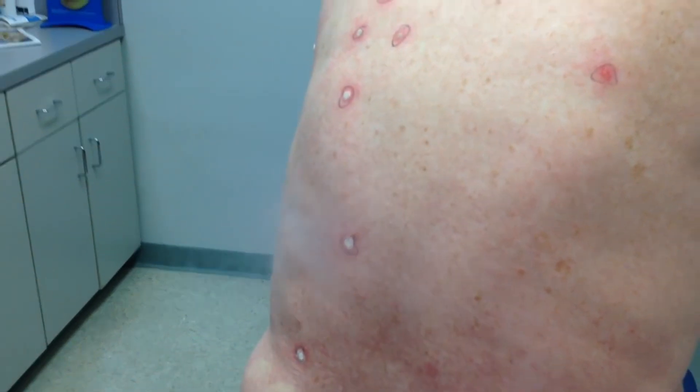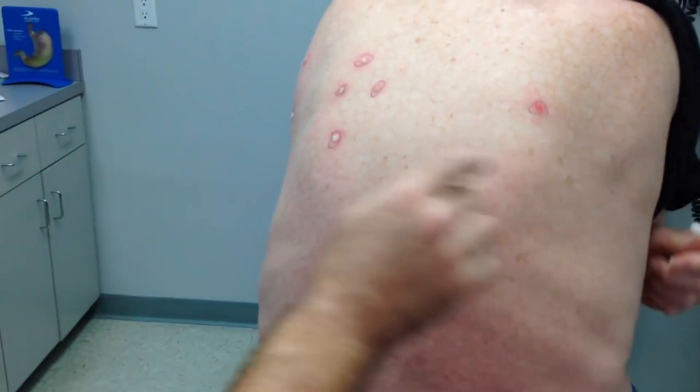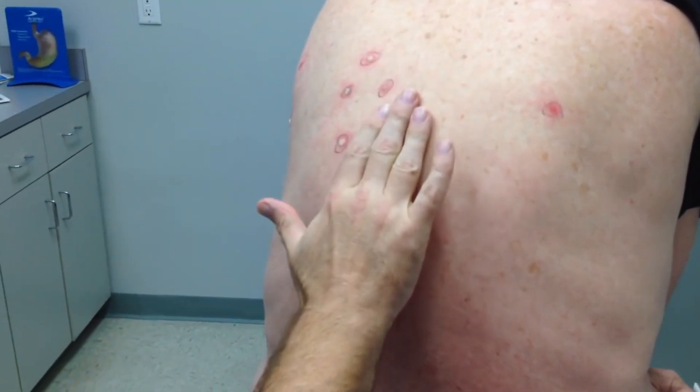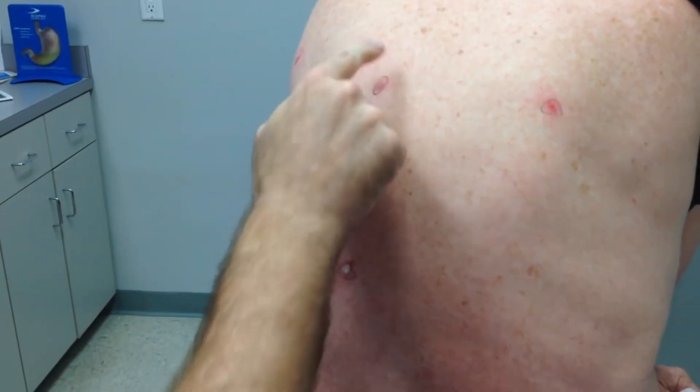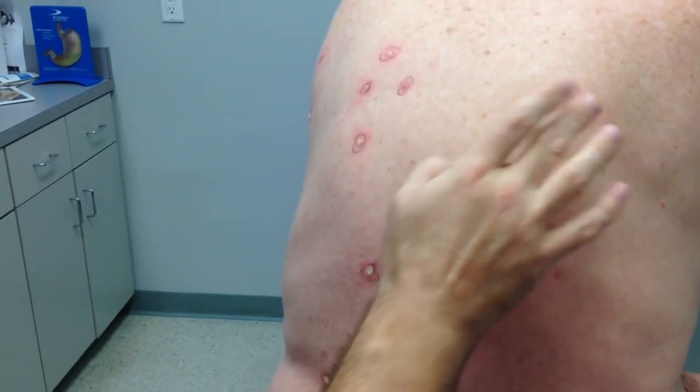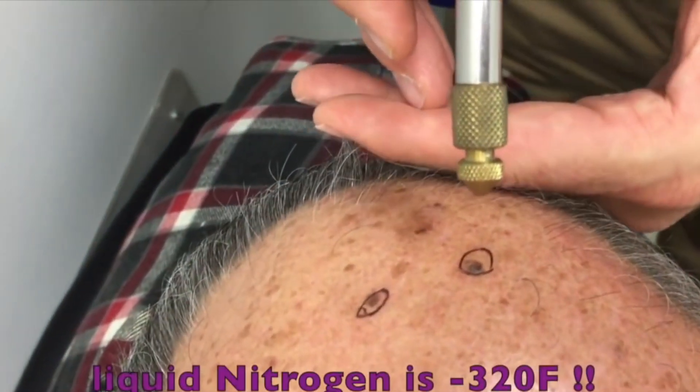All right, we're done! So that's it. These will get red and kind of angry-looking for a few days. They'll dry up and the little raised part of the tissue will just peel off. All right, we're gonna do these for you now — are you ready, my friend?